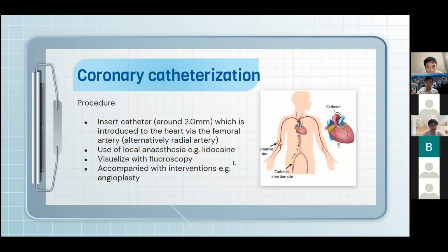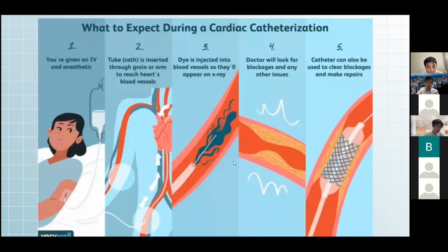And of course, there are also others such as transcatheter aortic valve replacement, etc. Basically, this is a conclusion of what the procedure of catheterization will be like.